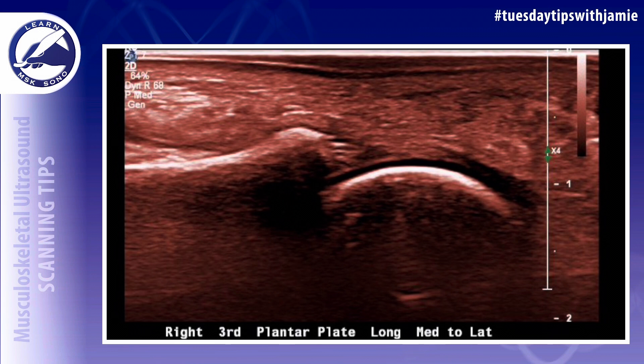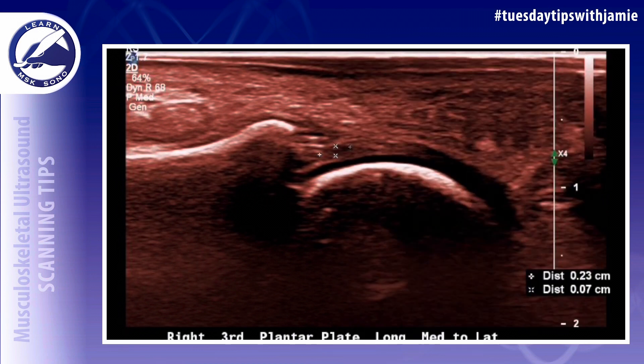Four, the proximal phalanx must be straight in the ultrasound image. This can be accomplished by holding the toe straight. It is very useful to have a foot pedal to perform this exam so that you have both of your hands free.